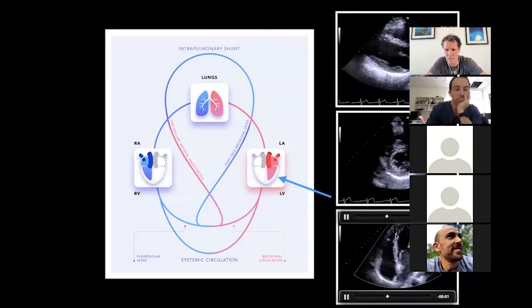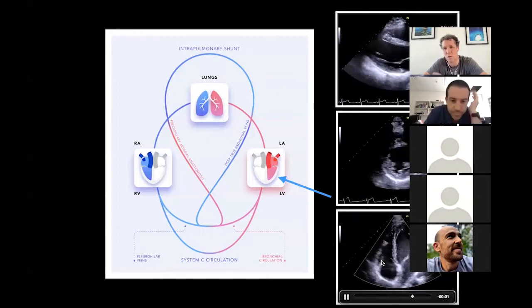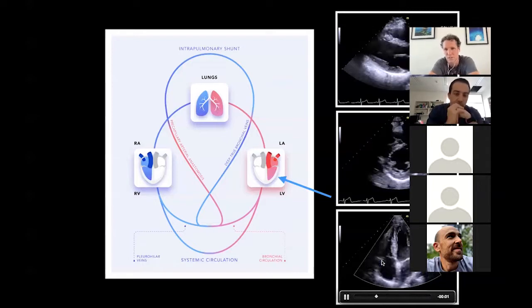Very nice. Sid, what are the walls of your apical four-chamber? Inferoseptal on the left and the anterolateral on the right. Very nice. Ben, so you're not feeling left out, we can see the right ventricle here in the apical four-chamber view. Can you tell me all measures of RV systolic function that you can get from your apical four-chamber view? You can use Doppler or whatever.